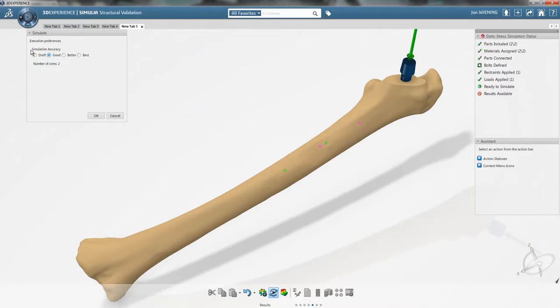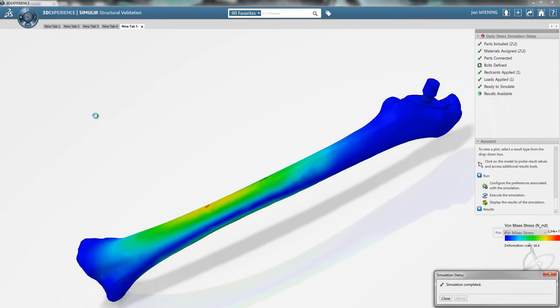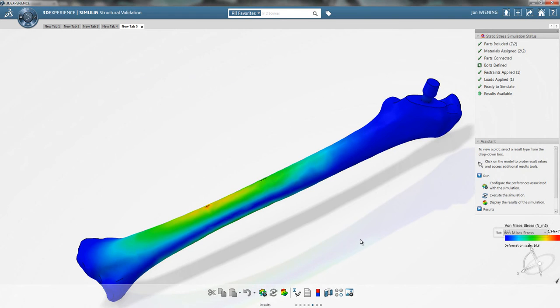I can choose first the simulation accuracy from draft to good to better to best, and choose the number of cores. In this case I'm running on 2 cores, and I hit OK to start the simulation. And with the simulation now complete, I can look at the results.